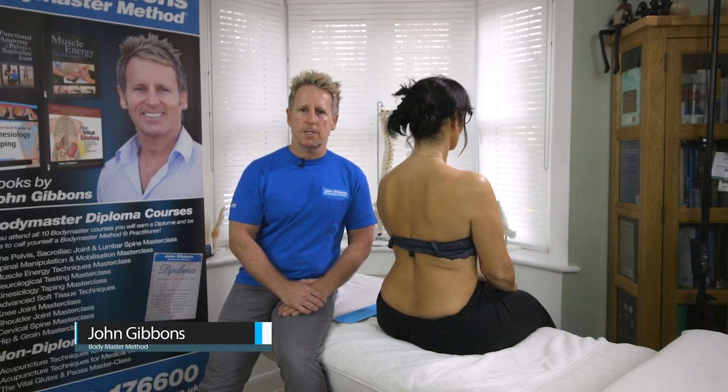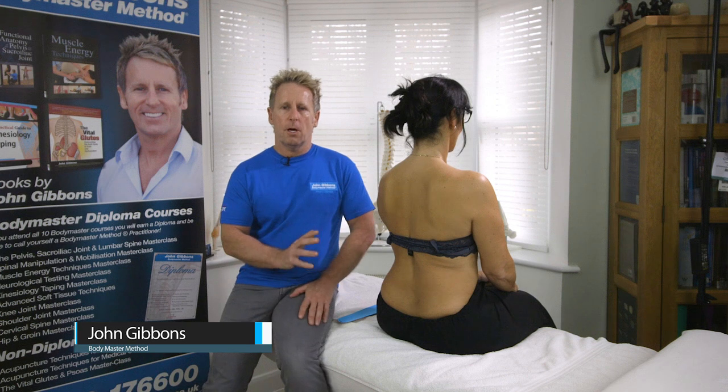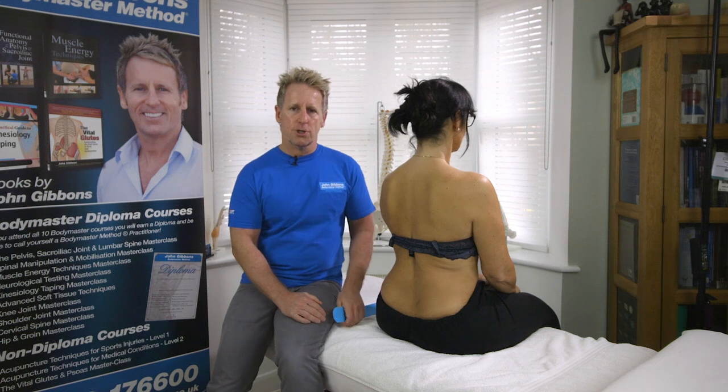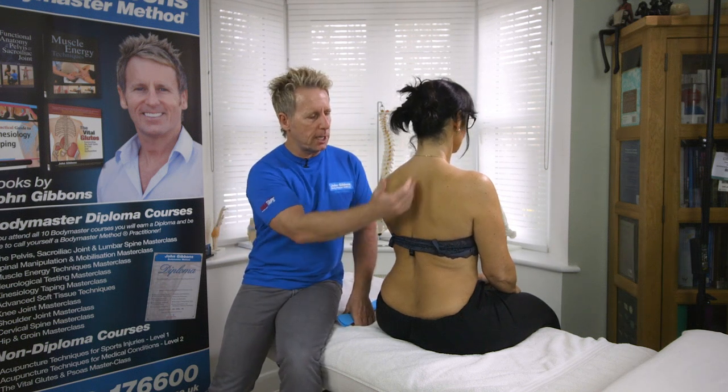Hi, my name is John Gibbons and today I'm going to teach you postural taping using K-tape. I always think sometimes the simple approach is the better approach rather than making it too complex. In other videos I show tape where we apply between the scapula and then two tapes coming down.